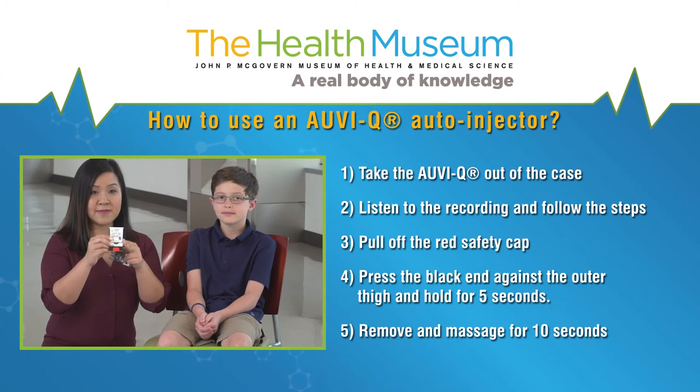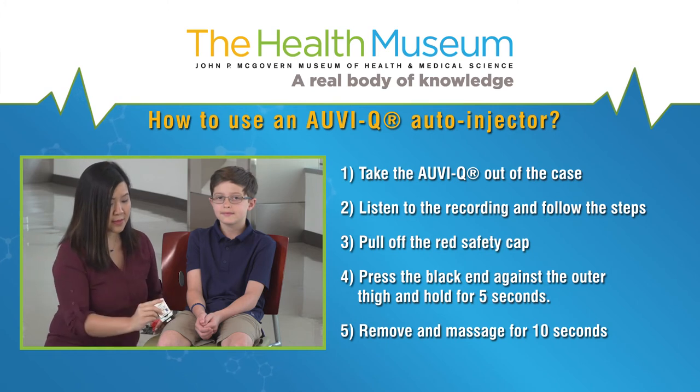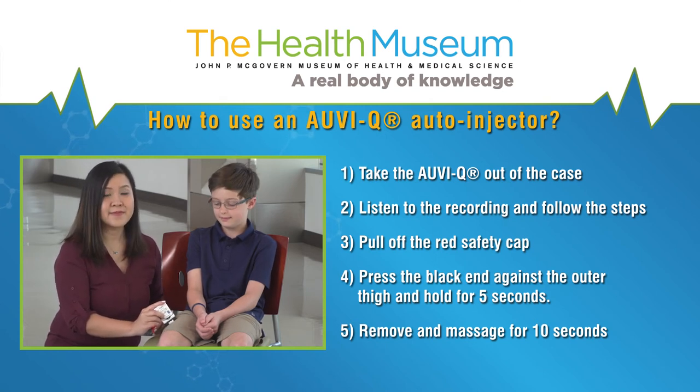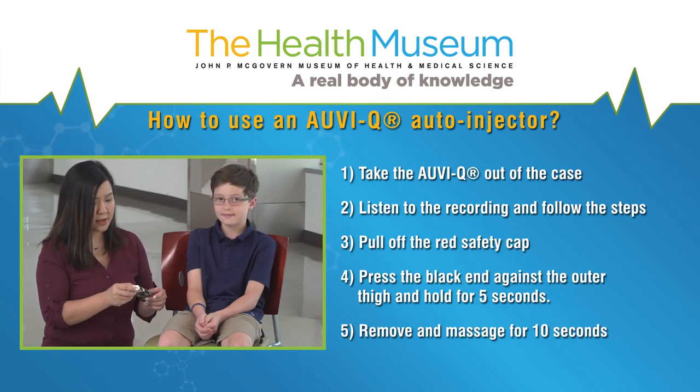Next, we have Auvi-Q. Auvi-Q will talk to you. If you are ready to use it, take the Auvi-Q out of the case. Pull off the red safety guard. To inject, place the black end against the outer thigh, then press firmly and hold in place for five seconds. Massage for 10 seconds.